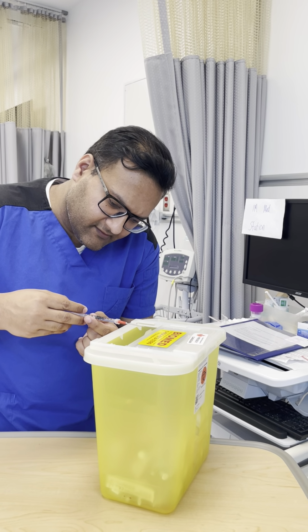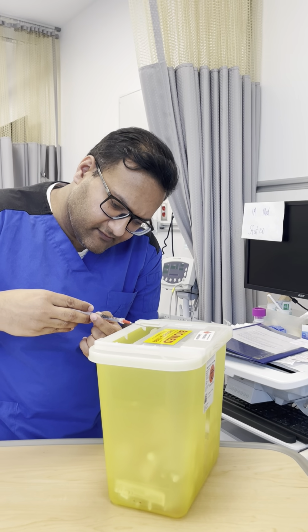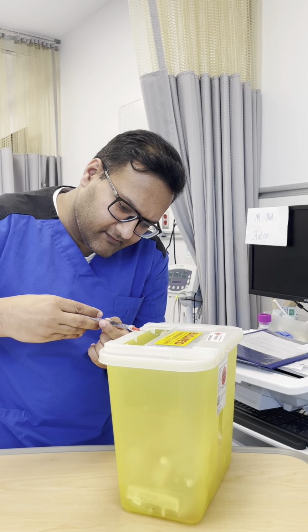And then we also introduce ourselves to the patient. Hi, my name is Krista. I am a Camosun College student nurse. Today I'm going to be administering your pain medication. Is it okay to do at this time? Perfect. Can I just have a look at your wristband? I'm just going to put your bed height a little bit up so that I can look at my wristband.